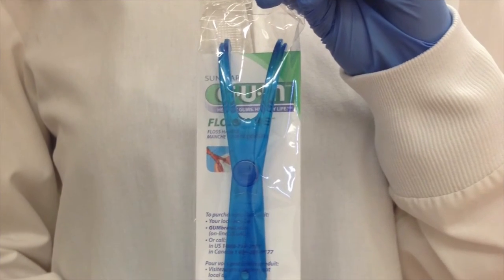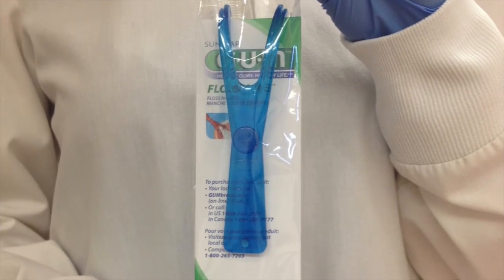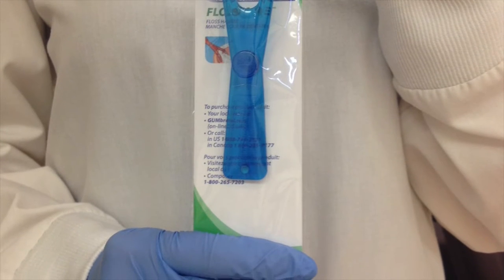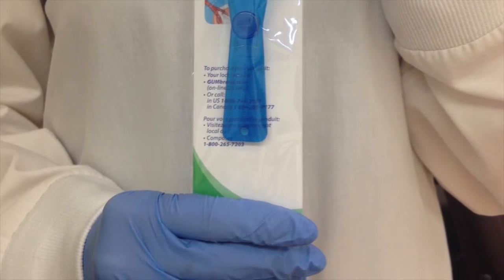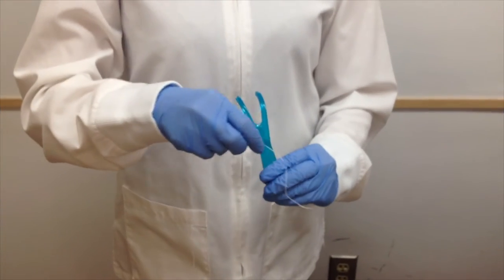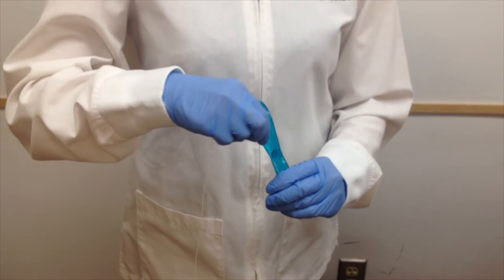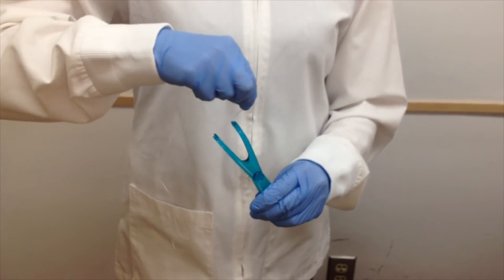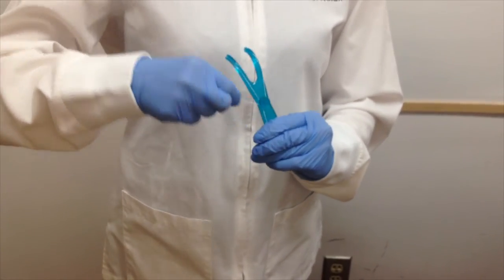Floss handle. A new portion of floss is wound around the device upon each usage. Good for patients who have arthritis or other conditions affecting dexterity. The handle is plastic and meant for long-term usage. The downfall of floss handles is that the floss cannot be adapted to the tooth anatomy, and if the floss is not wound tight enough, it may be difficult to get through the contact.